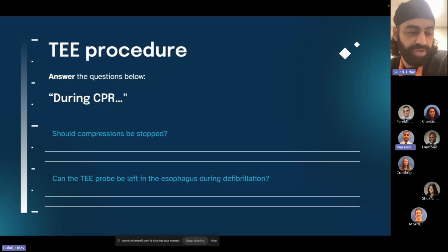Sure. If we go through some pictures and you look at the quality of these transesophageal pictures, even under emergent scenarios, you're getting pretty good pictures where you can make much more accurate assessments. And if you're one of those maestros and get really good at assessing valvular pathology, then imagine how much of a difference it can make when you're trying to manage these patients.